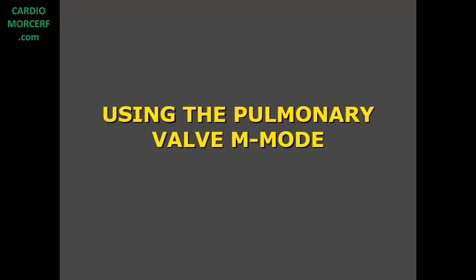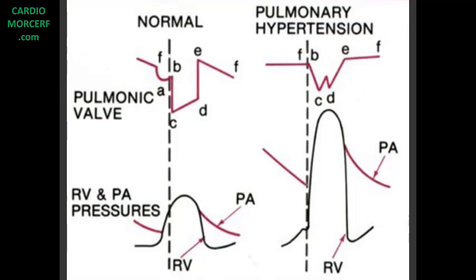Using the pulmonary valve M-mode, that's the best way to evaluate if there is pulmonary artery hypertension — not its value, but its presence. It's very simple to understand, and I only blame the absence of knowledge of M-mode nowadays for the reason why only a few echocardiographers use it. M-mode echo shows important abnormalities that may help us in this diagnosis.